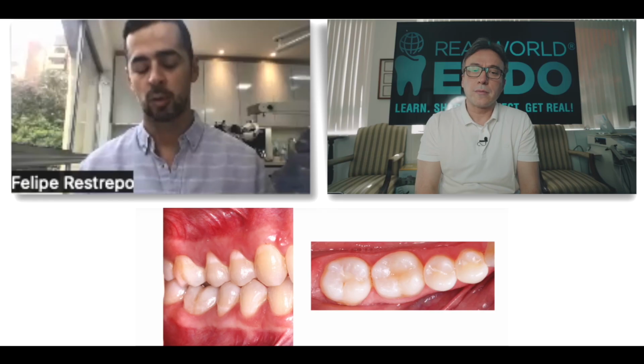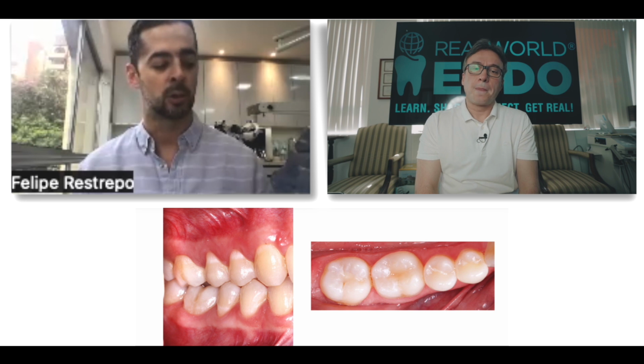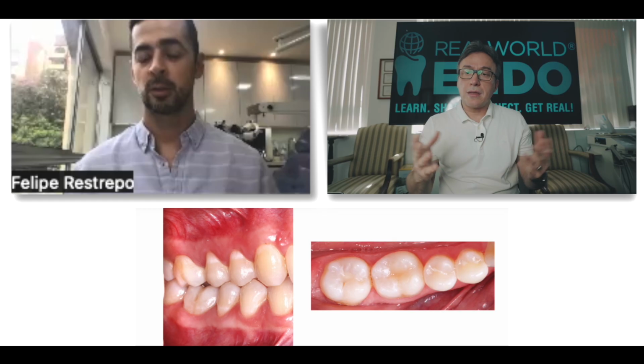You still did have your non-rigid physiological splint for a couple of weeks, right? Despite the fact that there was a larger opening than not? Did you have a couple of weeks of physiological splinting on this tooth as well? Yeah, 2 week splinting with orthodontic wire and resin composite. So 2 weeks was enough. Okay, perfect. Yeah, that was enough.